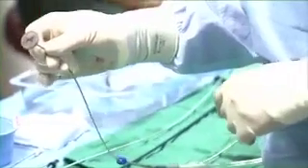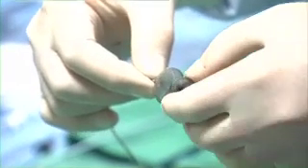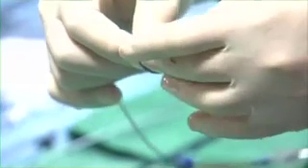Can they do a close-up of the device, and then, Ramon, can you pull it apart to see the two discs? Is that a possibility? Can you show a close view? So I'm pulling it apart right now. You see it? Perfect. I see the two discs and a little waist in between the two discs. Okay, so that's the closure device. Let me do it again? No, we see it. Do your normal procedure.